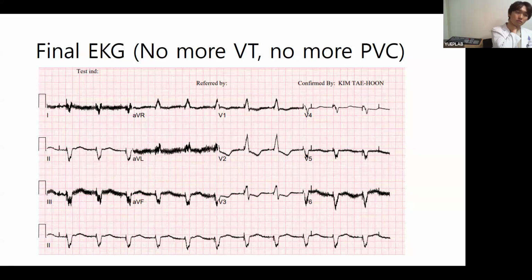and if you think LOT-CRT will be beneficial to the patient, then you can try CSP first, unless the septal scar is that huge. Just the presence of septal scar is not that big a deal. Another point is if the patient has frequent PVCs from the basal septum, you will burn the CSP point, so it's better to avoid.